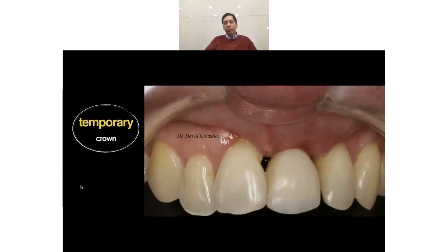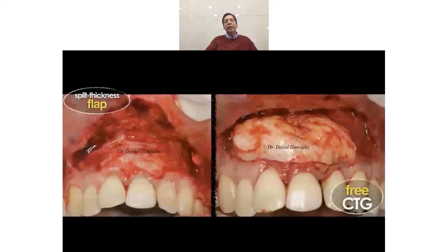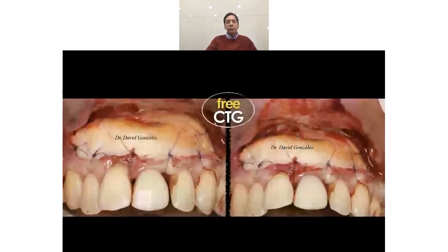Now we have a problem. We have a soft tissue problem because we have no keratinized tissue at all in here. So I need to reposition the mucogingival line. I prepare our bleeding recipient bed by making a split thickness flap. I remove all the elastic fibers and I place a CTG from the palate. And I fix the CTG with interrupted sutures very easily.